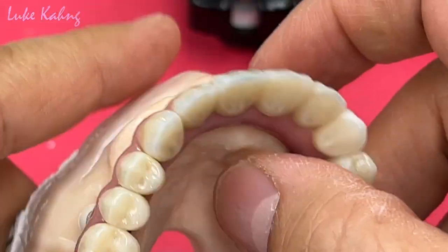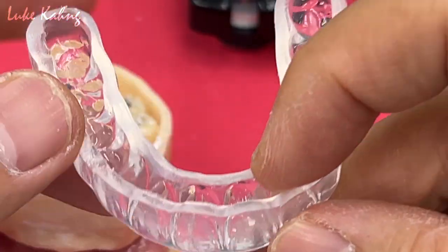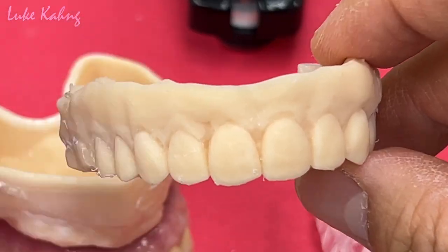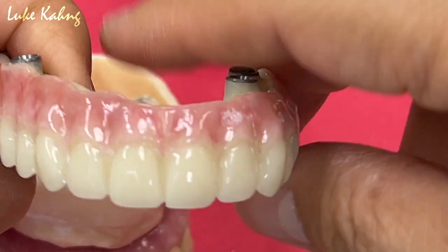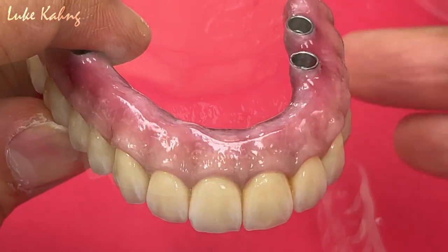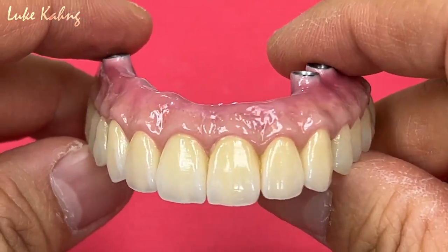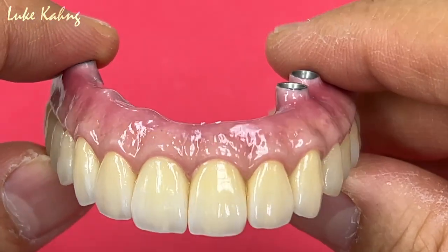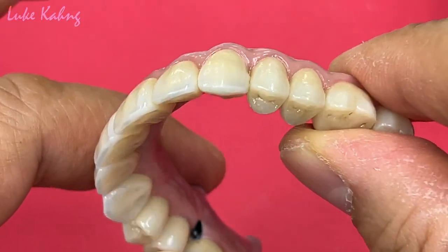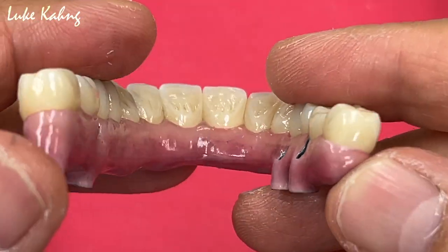No composite involved. From here, the STLs, and here's a PMMA, and then this is the final goal. It's an extremely huge span with the four implant cases. Let's finish it with cement using the GC clear color GSM cement, no composite involved.